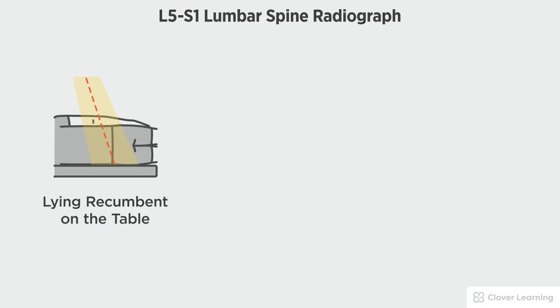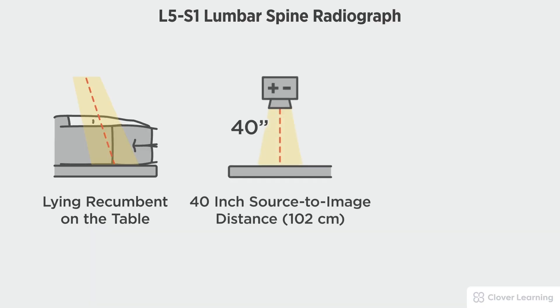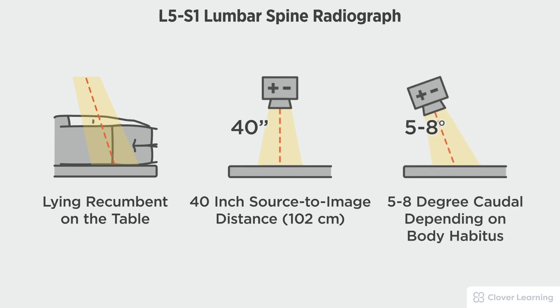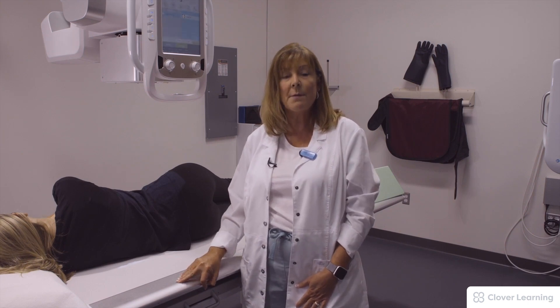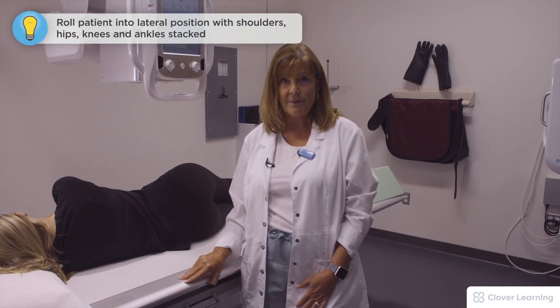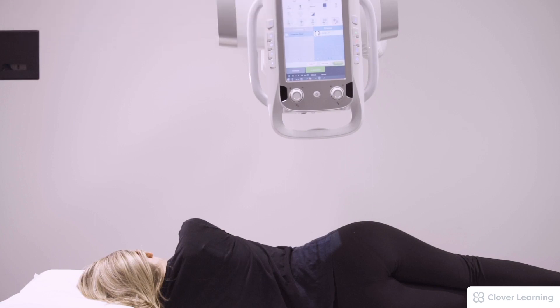In this view we will be demonstrating the lateral L5-S1 of the lumbar spine. The L5-S1 view should be performed with the patient lying on the table with a 40 inch source to image distance and a 5 to 8 degree caudal tube angulation depending on sex or body habitus. This is a spot film of L5-S1, the lower lumbar and first sacral area.